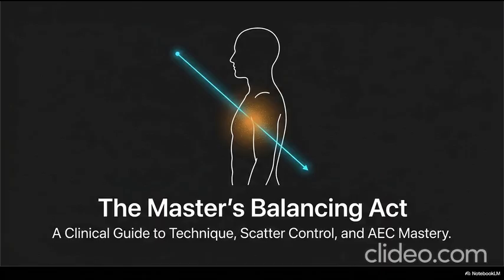And there are massive clinical traps waiting for you, even if your positioning is perfect. Oh, absolutely. Take a patient with a total hip replacement made of dense surgical titanium. If you place the AEC chamber directly under that titanium hip, the metal absorbs virtually all the primary X-rays.